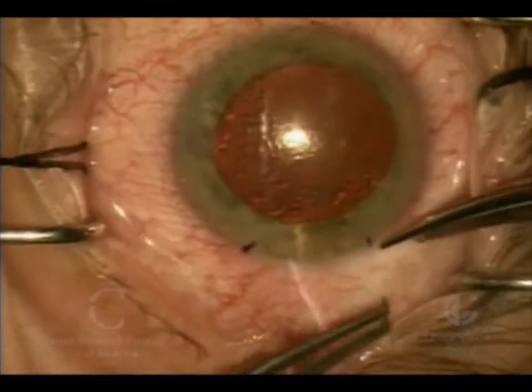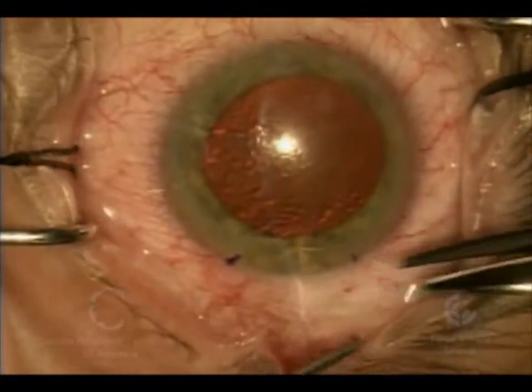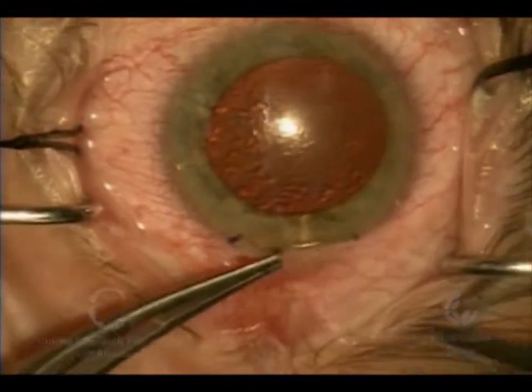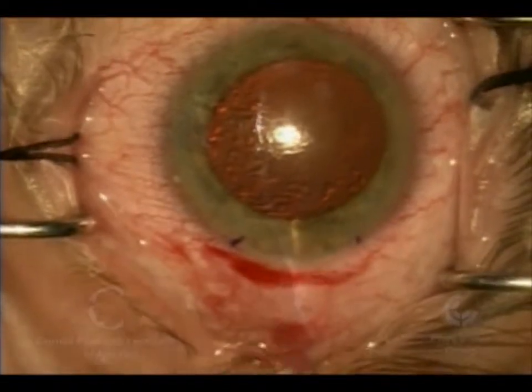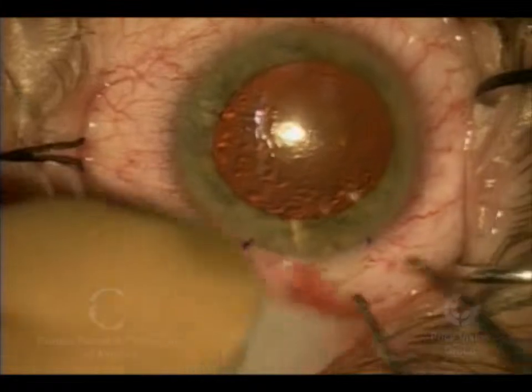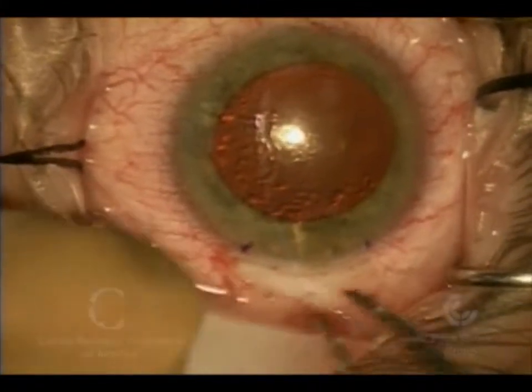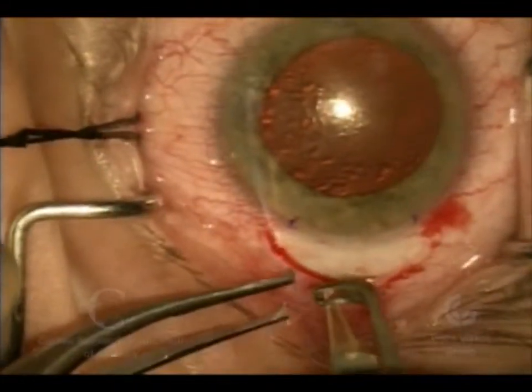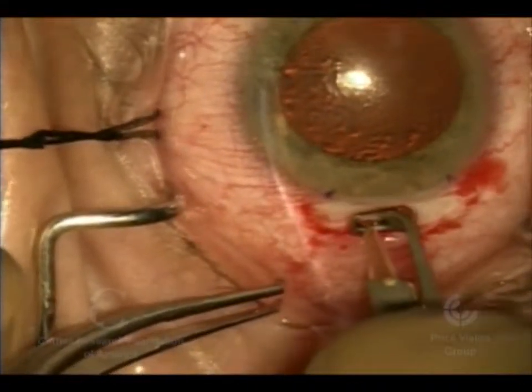We're going to make a small incision here in the conjunctiva right at the edge of the cornea. This case is being done for Fuchs dystrophy, a hereditary condition that causes the cornea to become hazy or cloudy, sometimes even causing blisters. It can also be used for other situations where the cornea loses its clarity due to dysfunctional or damaged endothelial cells — the inner layer of cells.